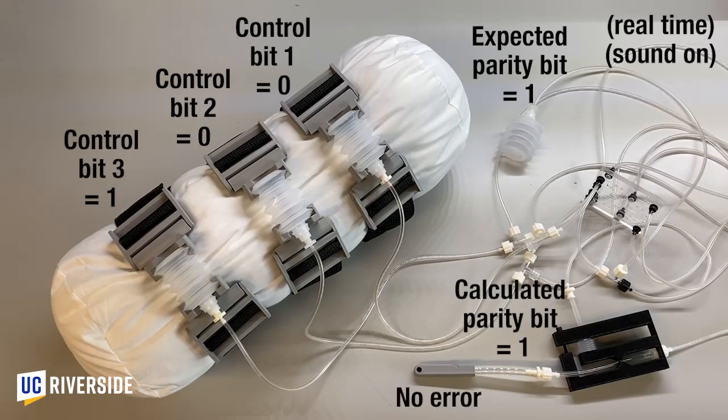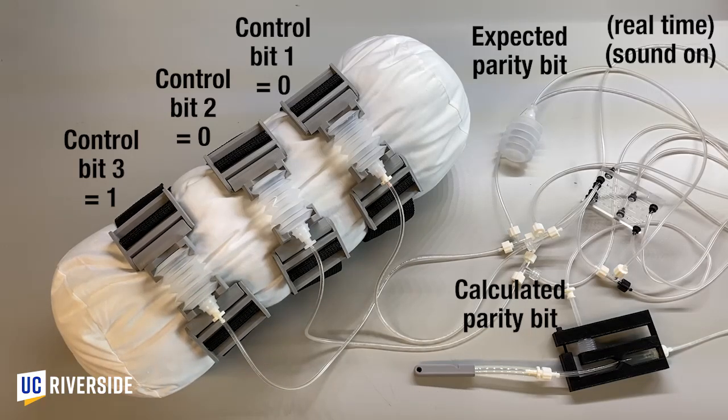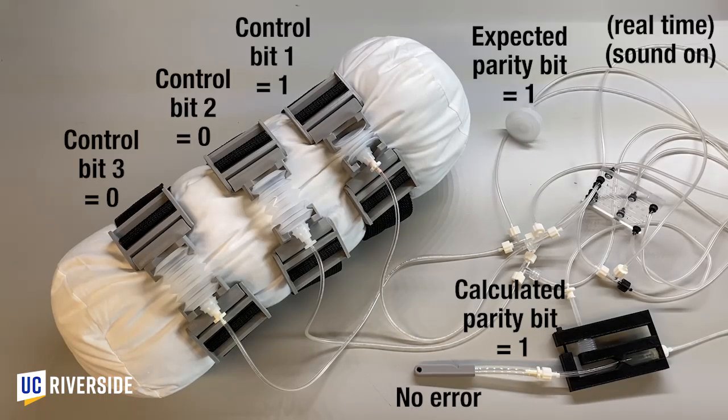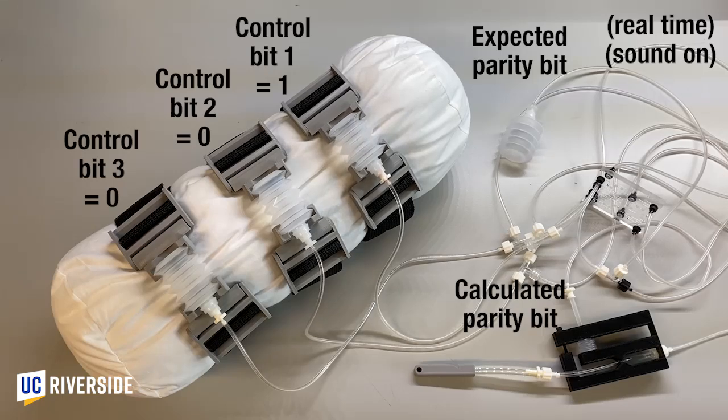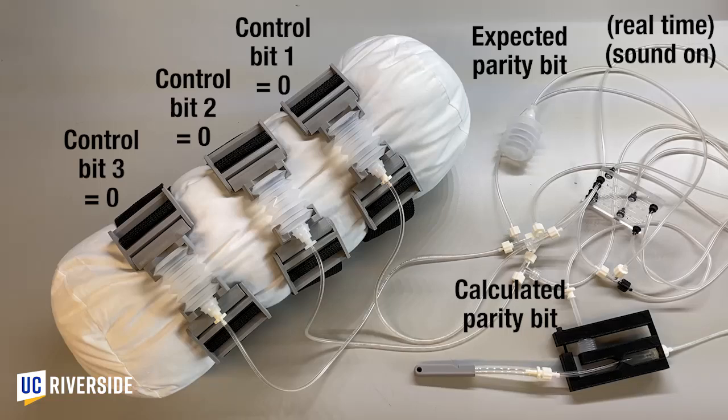The error signal stops while the other control bits are being operated, but it resumes in a few seconds when control bit 2 again receives vacuum. In this manner, the pneumatic error detector will continue to alert the user of the error condition until the error is resolved.